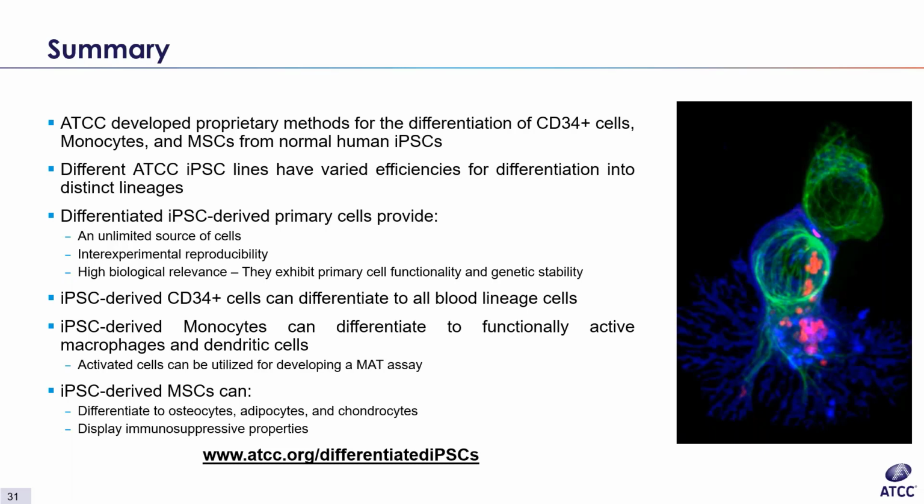And here's another question about passaging. What dissociation reagent is recommended for passaging the MSCs? Is any special medium used? All right, so for passaging the iPSC-derived mesenchymal stem cells, you'll want to use trypsin EDTA that's qualified for primary cells. We have that. It's part number PCS-999-003. We also have a trypsin neutralizing solution that pairs well with that. It's part number PCS-999-004.